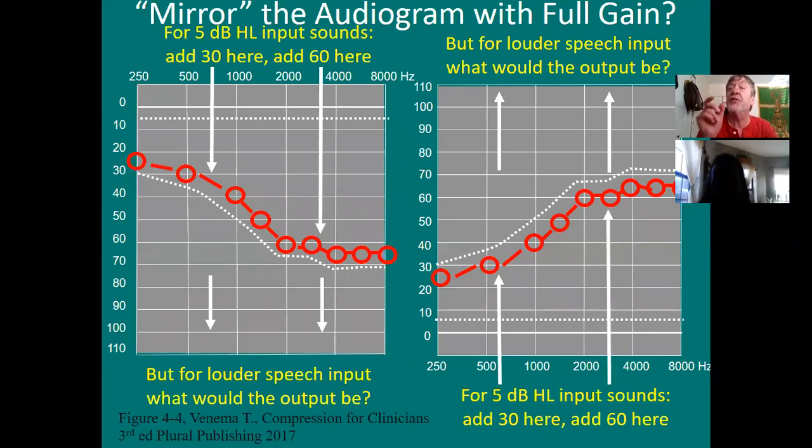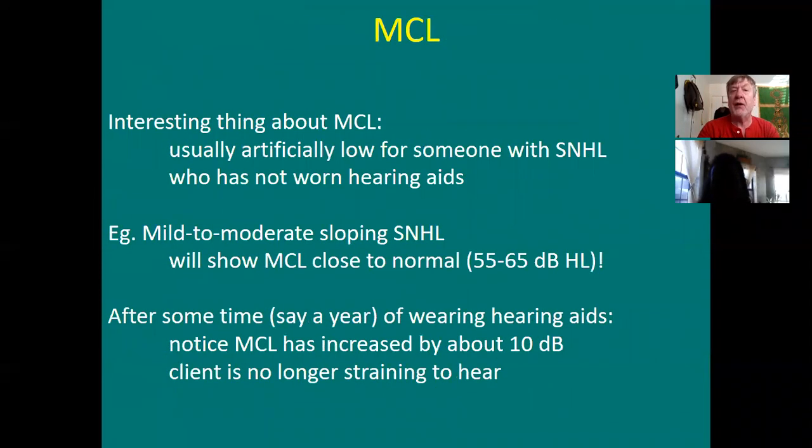And then you're going to do his speech discrimination testing. And guess what? He's going to do badly. And then you know what I would do? I would do MCL plus 10. Here you go. Read this with me.